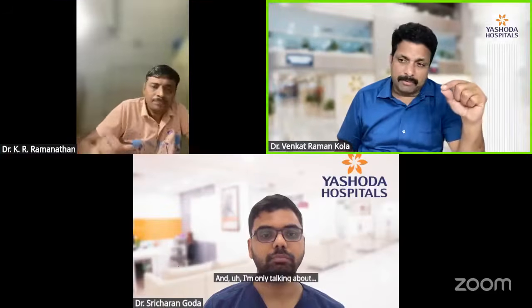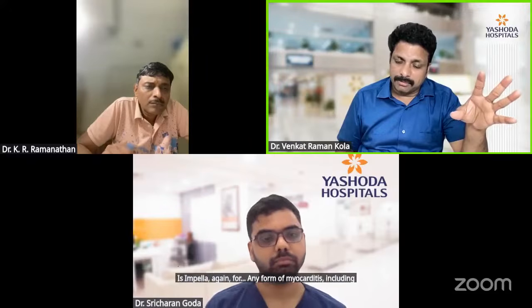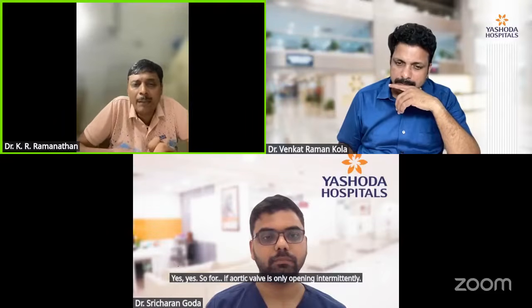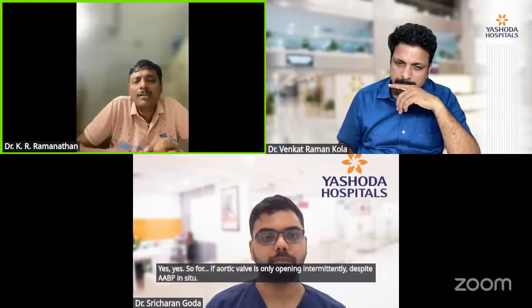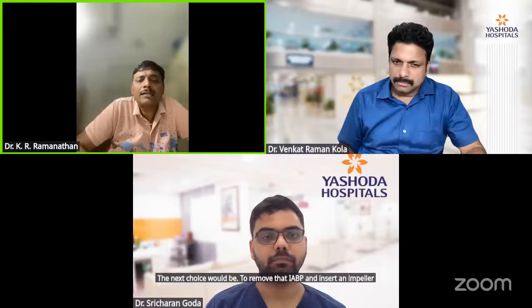Is Impella used for any form of myocarditis, including biventricular failure? Yes. If the aortic valve is only opening intermittently despite IABP in situ, the next choice would be to remove the IABP and insert an Impella so that the LV gets unloaded properly.